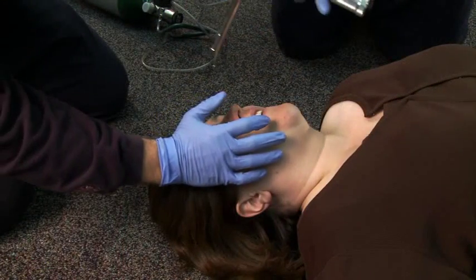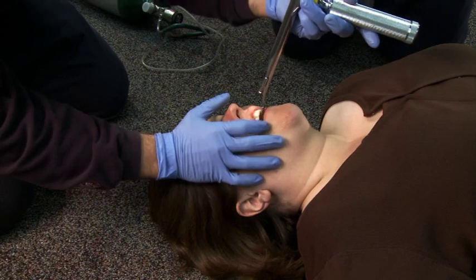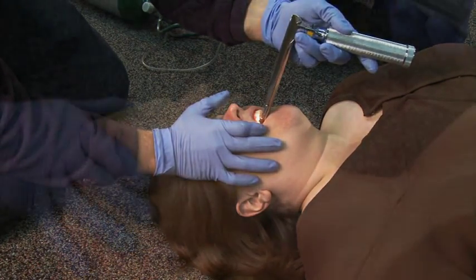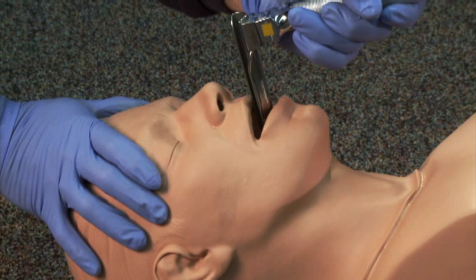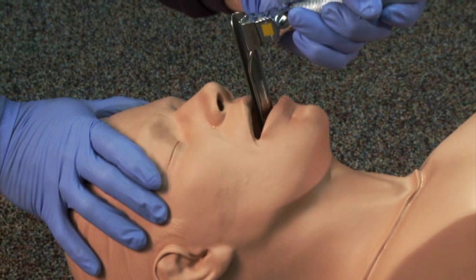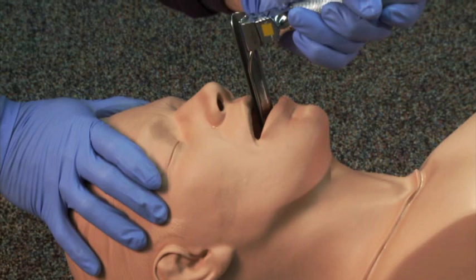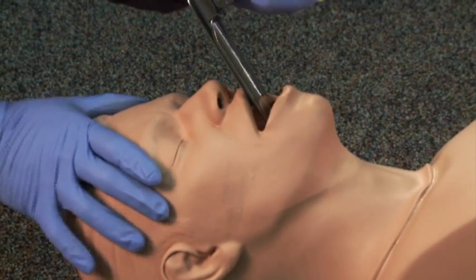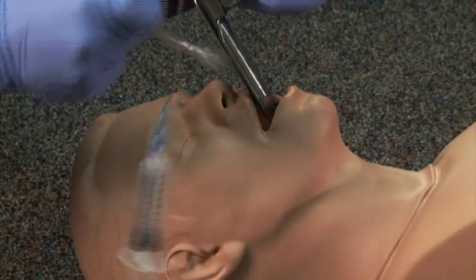Assume a position above the patient's head. With the laryngoscope in the left hand, open the patient's airway and insert the blade into the mouth and behind the tongue. Continue inserting the laryngoscope blade into the posterior pharynx. Lift up and forward with the laryngoscope handle and visualize the vocal cords.